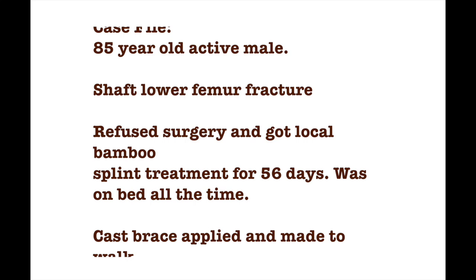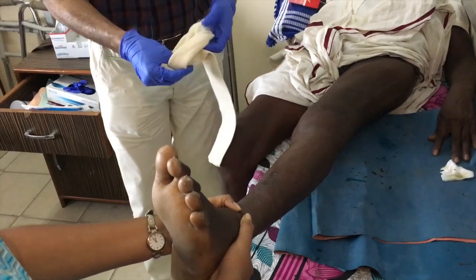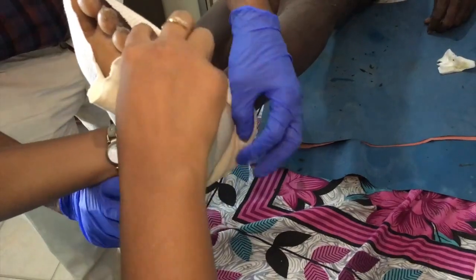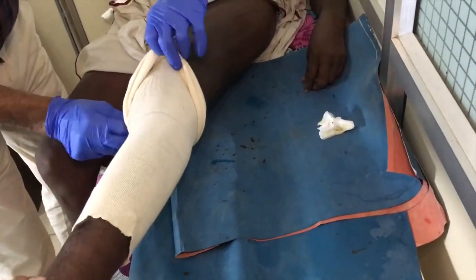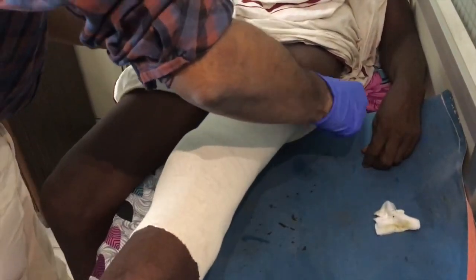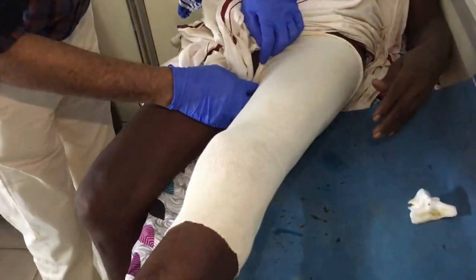Here is an 85-year-old active male with a fractured shaft of femur who was treated by a local bone setter with bamboo splintage for close to two months. This video demonstrates the application of a femoral cast brace for conservative management of fractures of the shaft of femur.